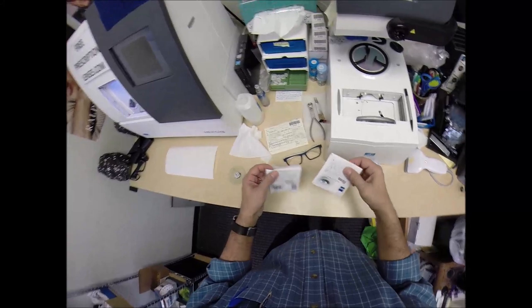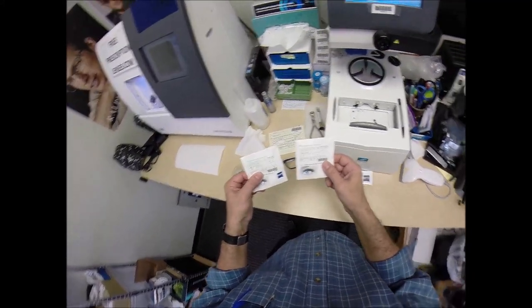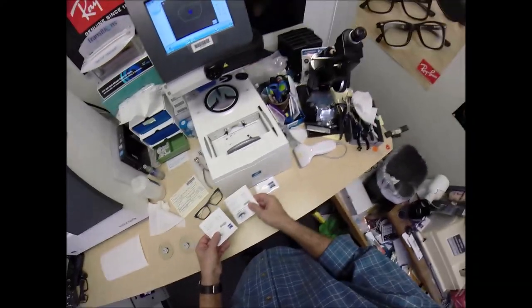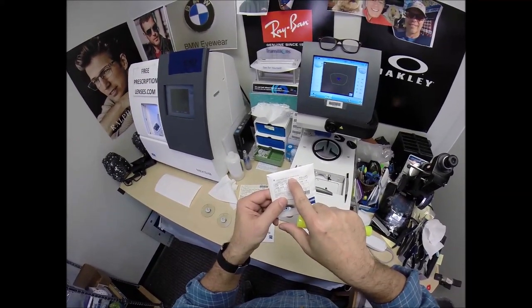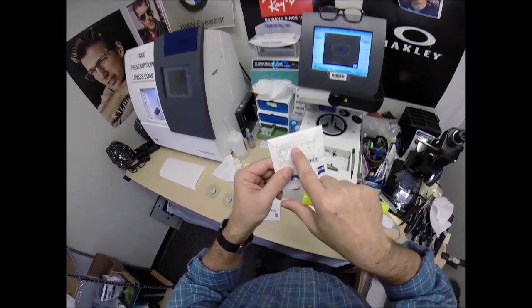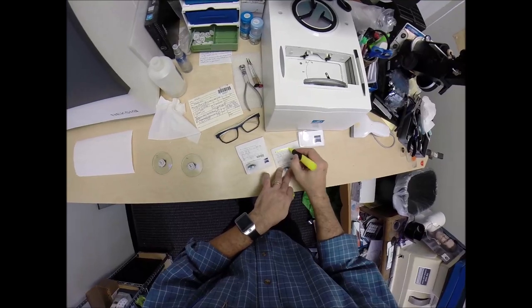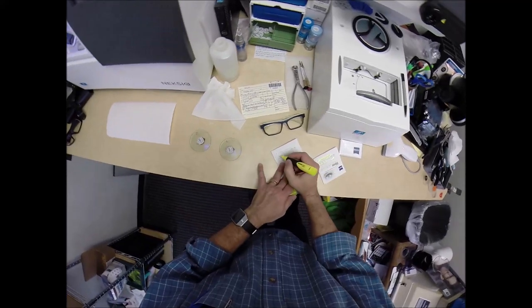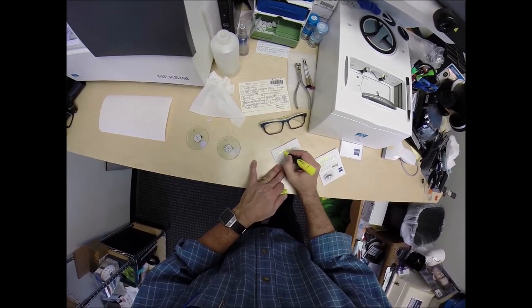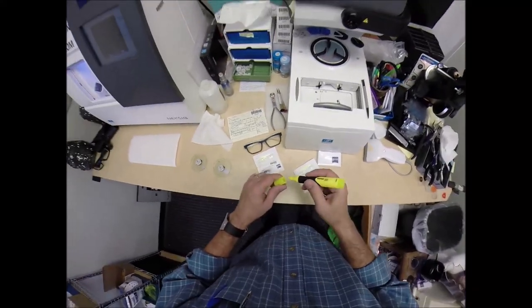Normally we get an 8x11 piece of paper from Zeiss telling you exactly what you're receiving, but they haven't provided that this time. At least the lens packets tell us: this is the Zeiss Progressive Light D 1.59, which is the refractive index of polycarbonate, Photofusion Blue. The DP stands for Duravision Platinum. Right eye power: minus 1.50, minus 2.50 at axis 97 with a 2 add. Left eye: Duravision Platinum, minus 1.25, minus 2.75 at axis 84 with a 2 add.